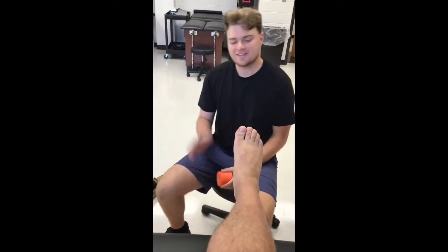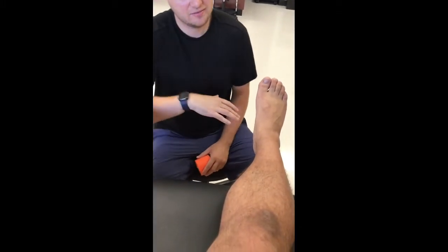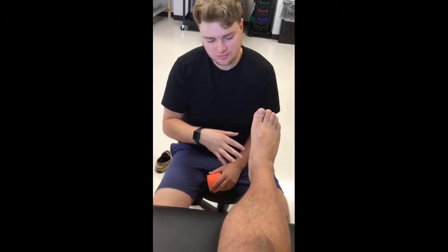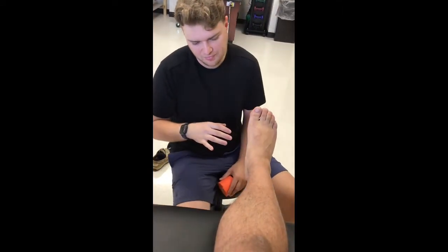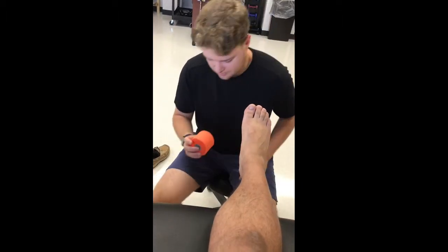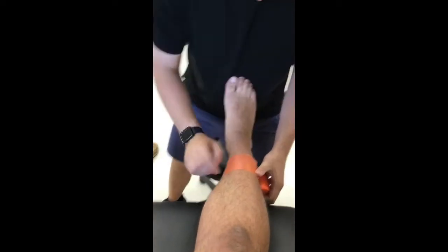Okay, alright, so Marcus has come in here, he's our athlete today, and we have figured out that he's got a medial ankle sprain. So what we're gonna do is a tape job on his foot, and we're also gonna make a modification to help keep that from happening again and relieve some of the pain. So we're gonna go ahead and get some pre-wrap on him.